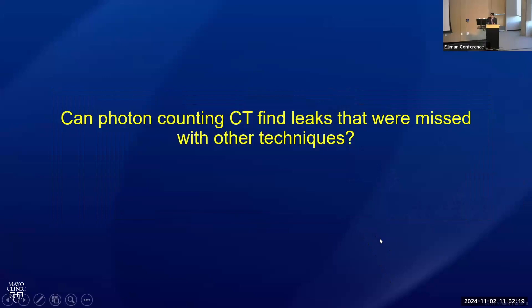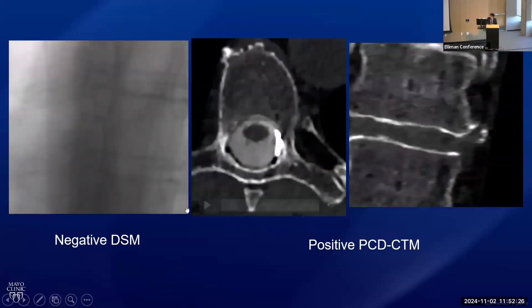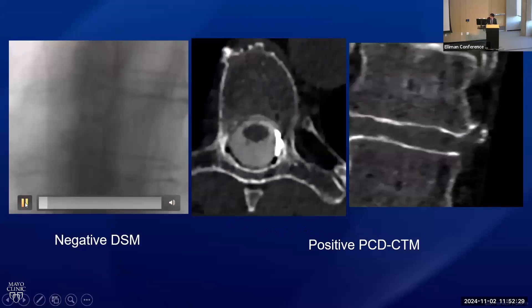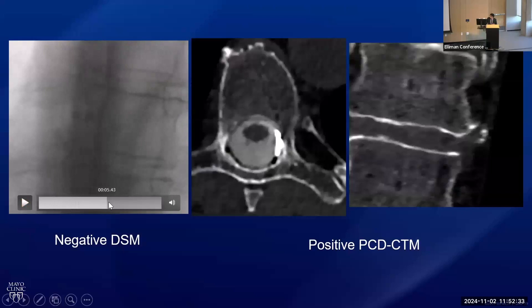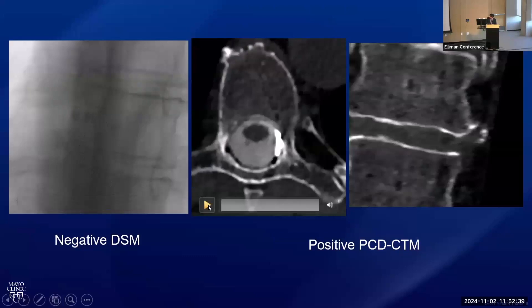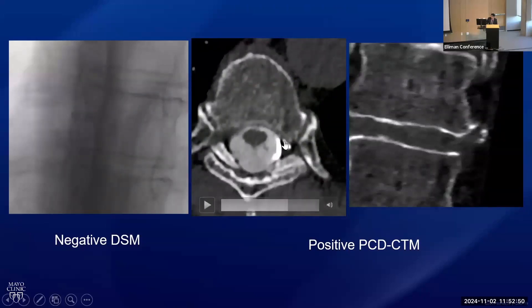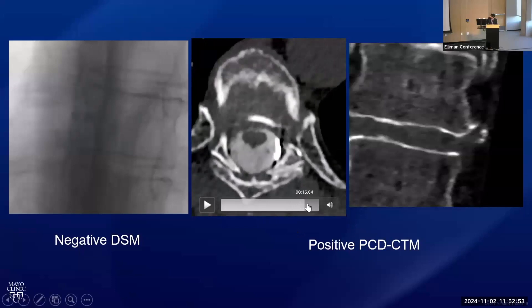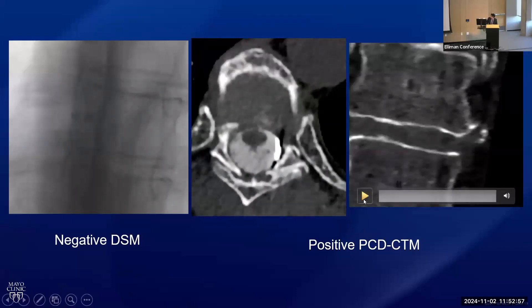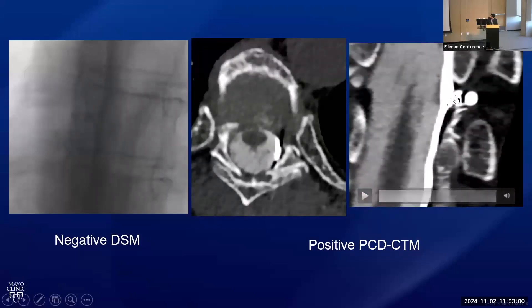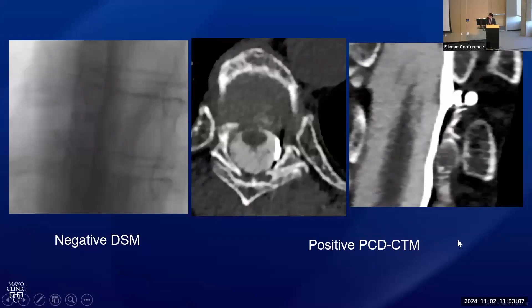A question I often get is: can you actually use photon counting CT to find leaks that were missed on other techniques? The answer is sometimes yes. Here's a patient where we initially did a digital subtraction myelogram — scrolling through, there's really no fistula. There was a prominent bilobed diverticulum, but we never saw a vein fill. We repeated the study on photon counting CT and you can see the same bilobed diverticulum, but as I continue to scroll down there's also a vein in the internal epidural venous plexus filling up with contrast, continuing out laterally. On the coronal image you can clearly see the bilobed diverticulum and that vein — without cross-sectional high-resolution imaging, that would be a very hard fistula to appreciate.